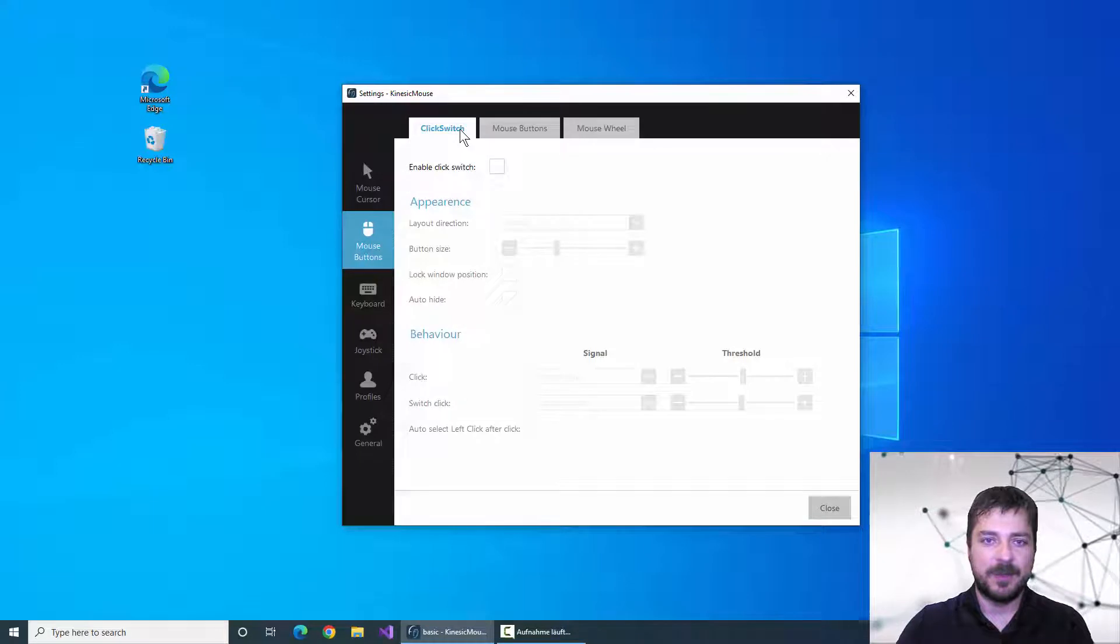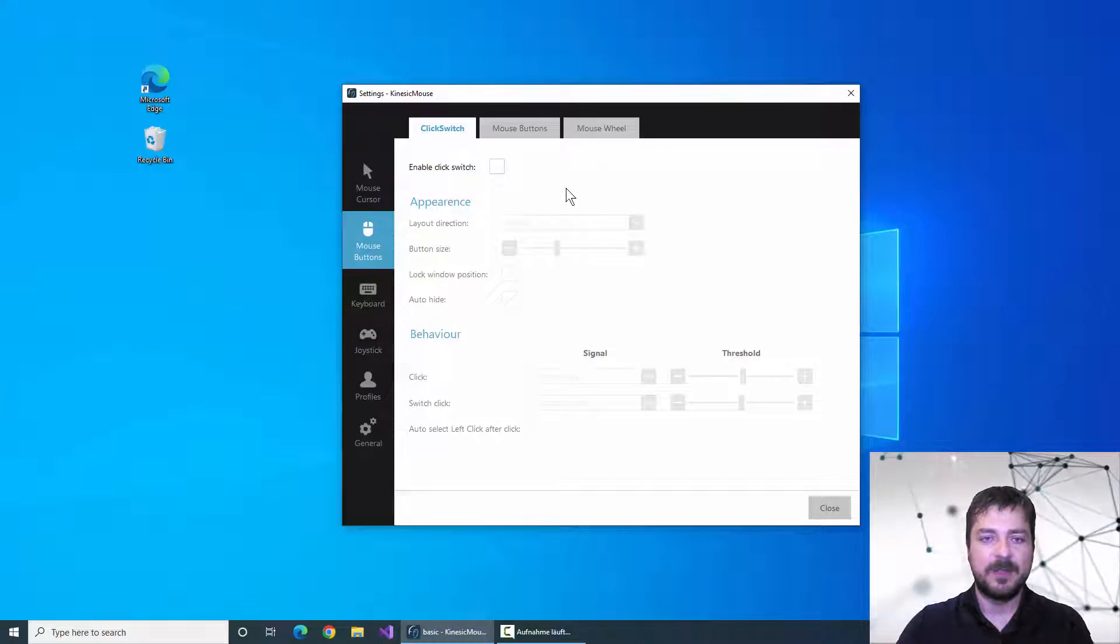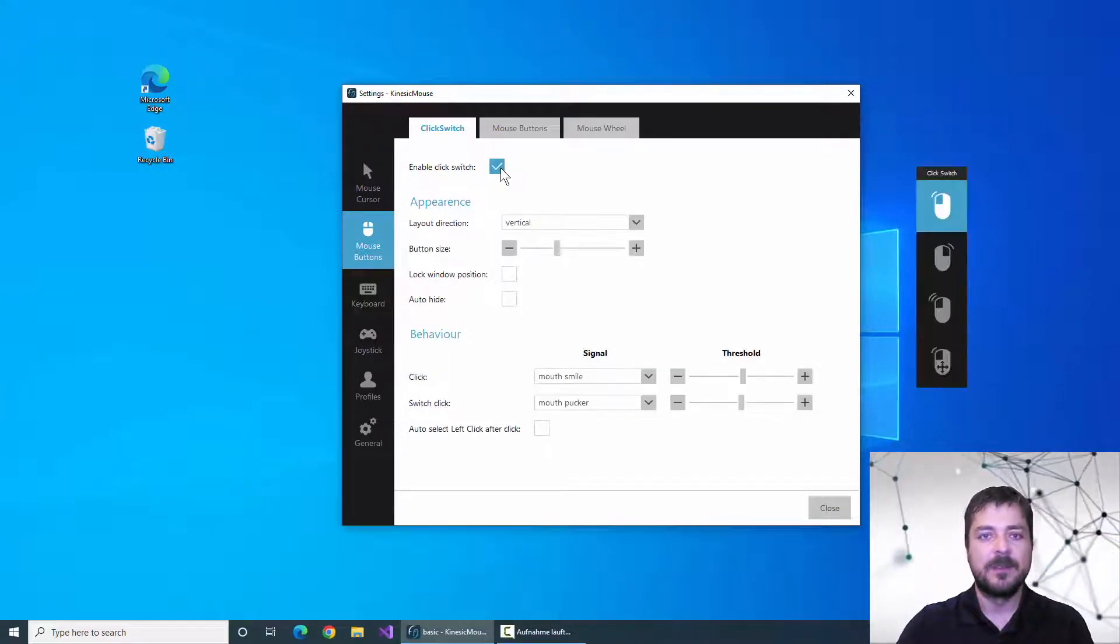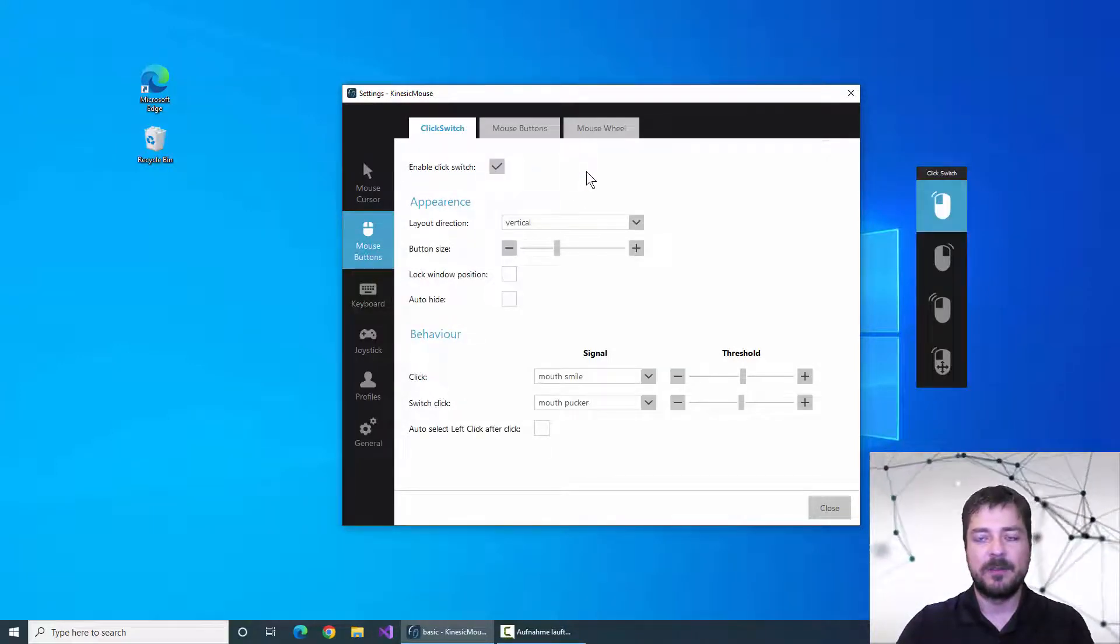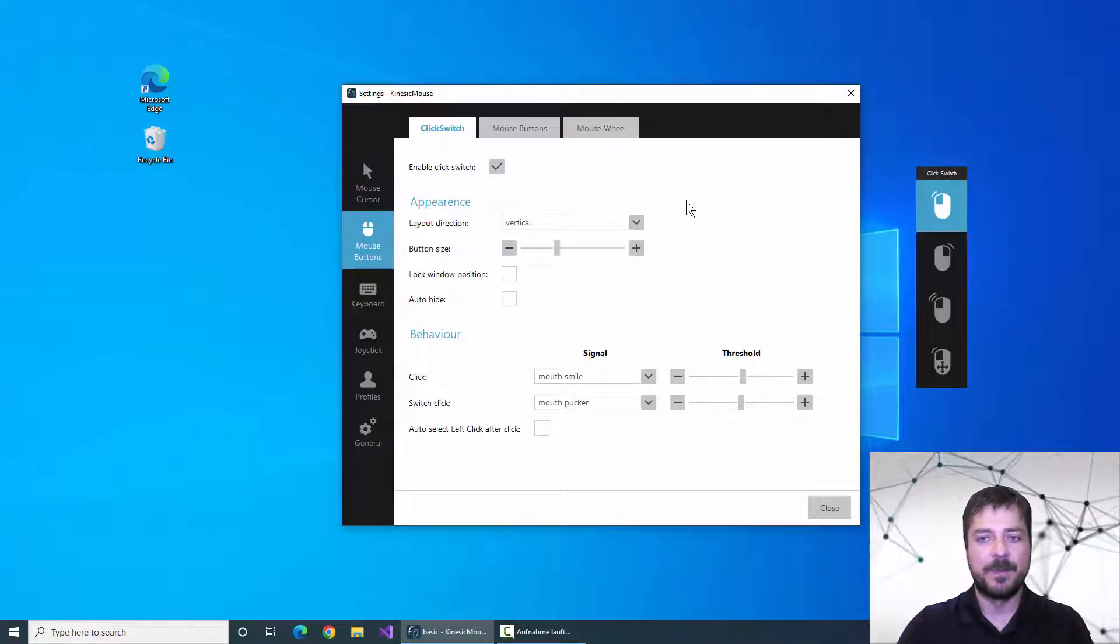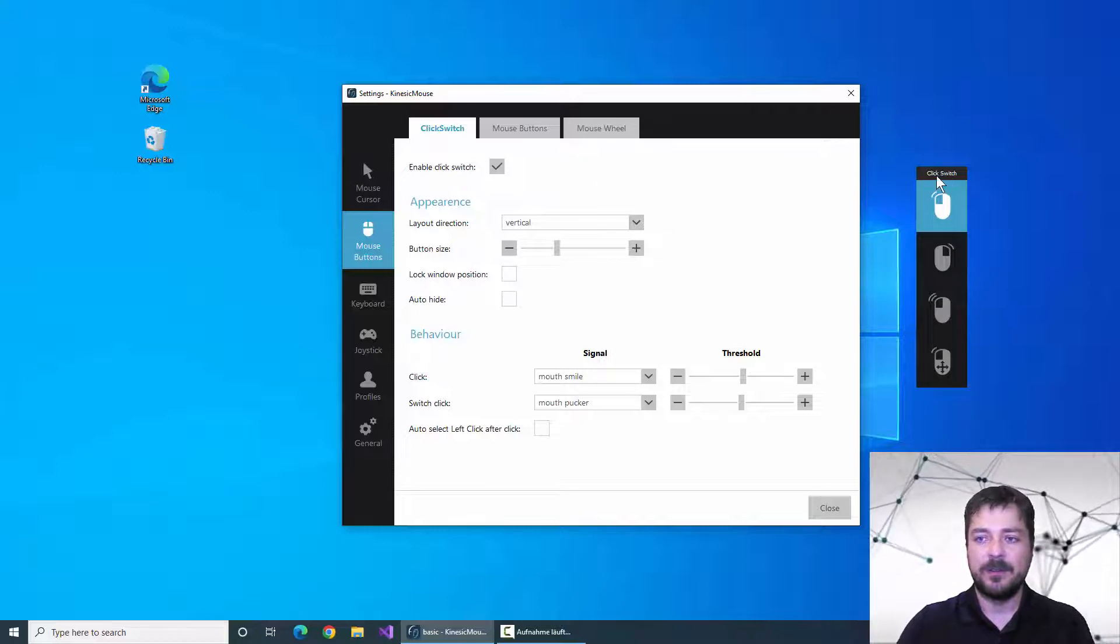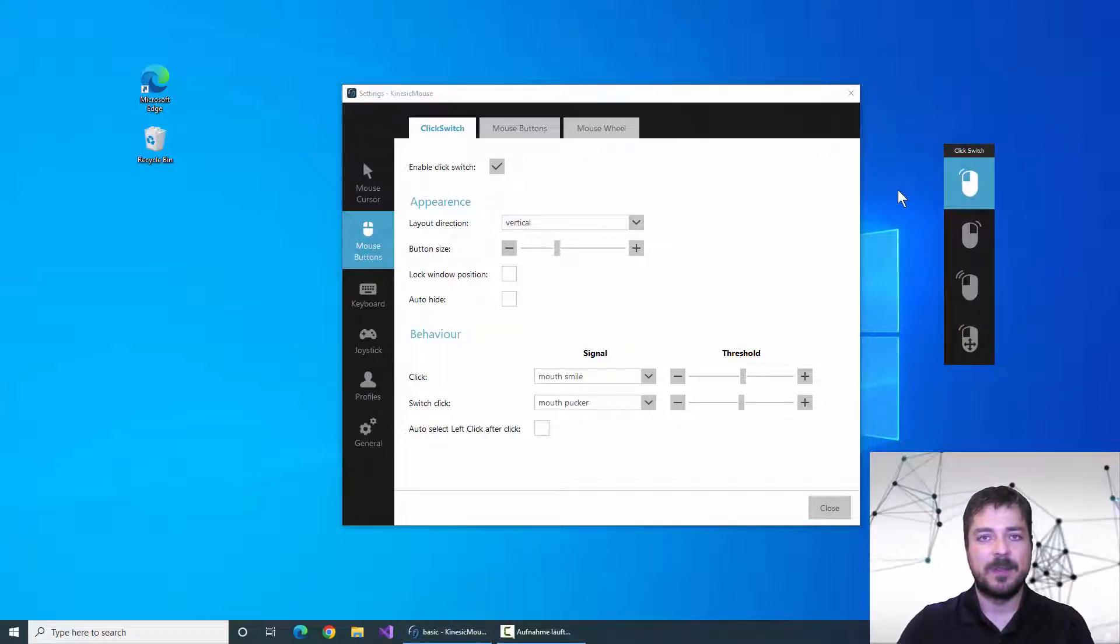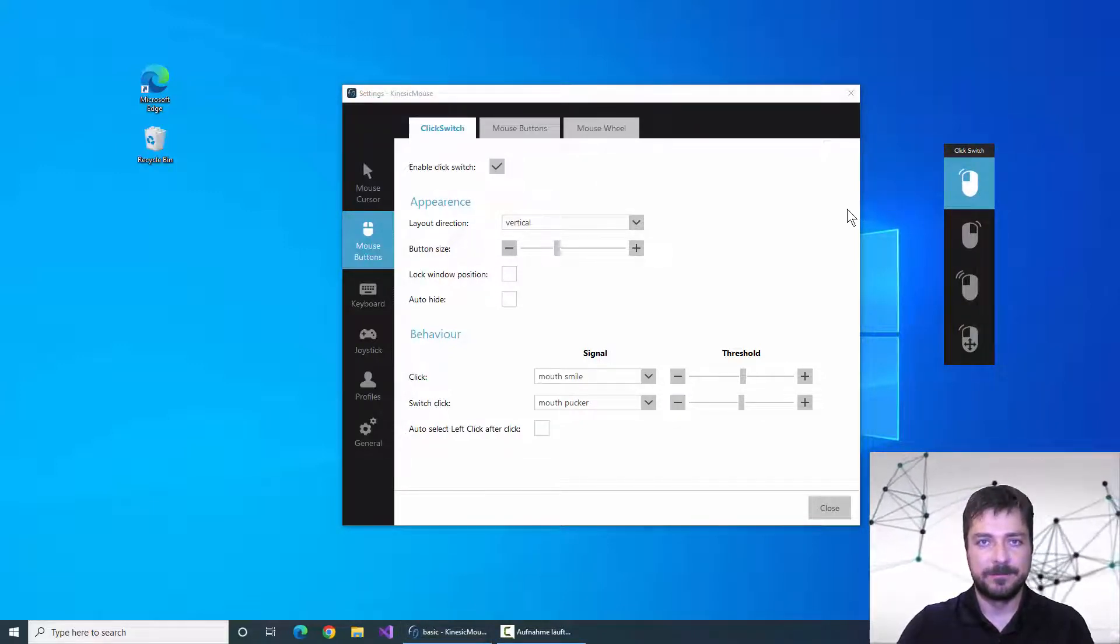So let's go back to the click switch menu and here we can see the enable switch and on the right side we can see that these mouse buttons appear.